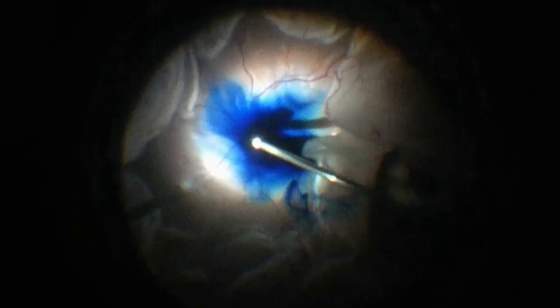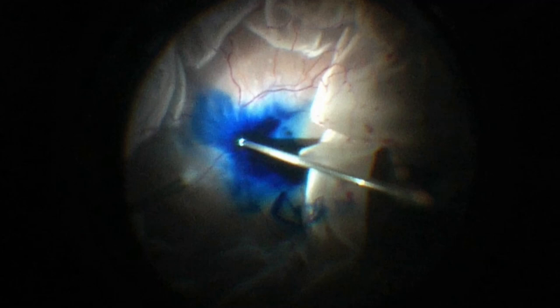Using a scleral depressor, the surgeon is able to safely remove the vitreous from the base using parameters with high cut rates and low vacuum. It's also important to remove the anterior flap of the giant retinal tear in these cases.